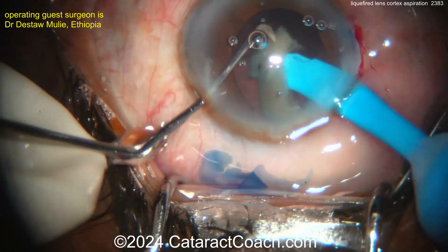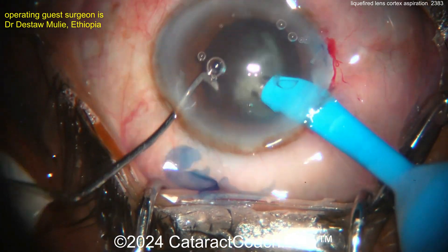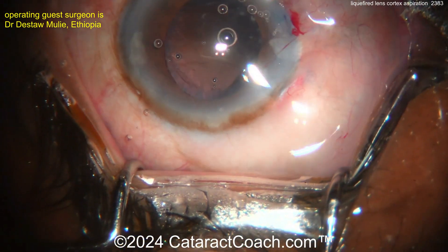Remember, there's basically no or minimal cortex there to weigh down the capsule bag. Efficient nucleus removal, beautifully done.